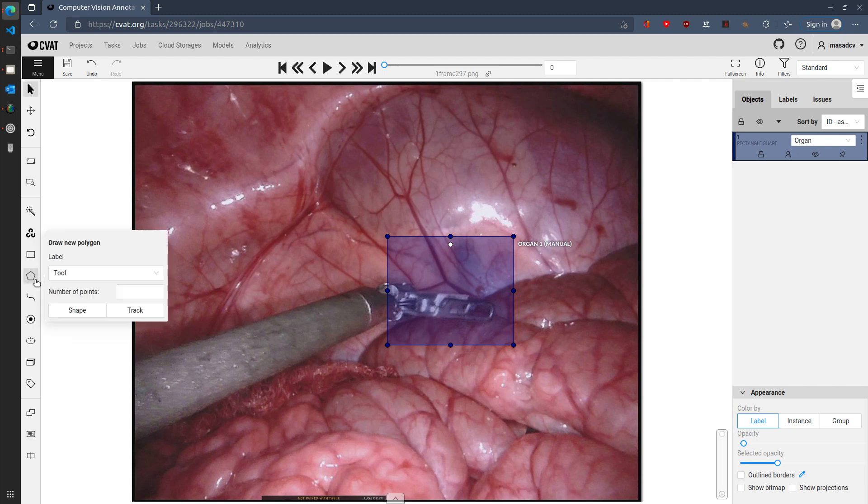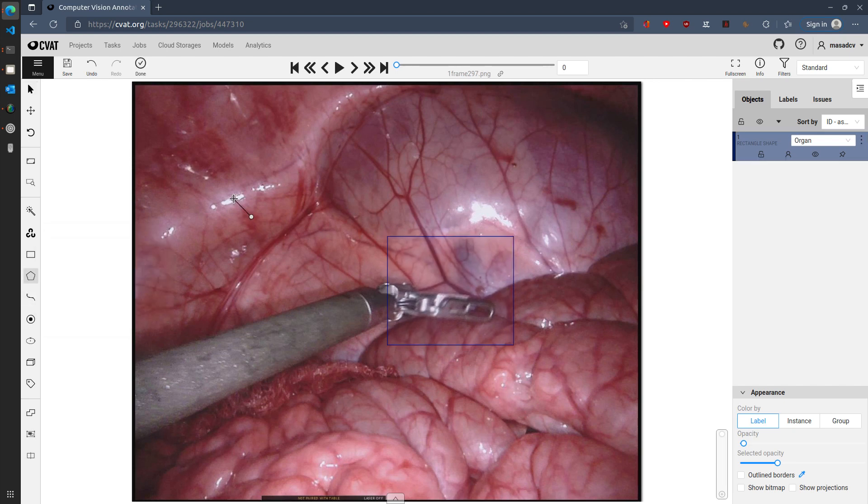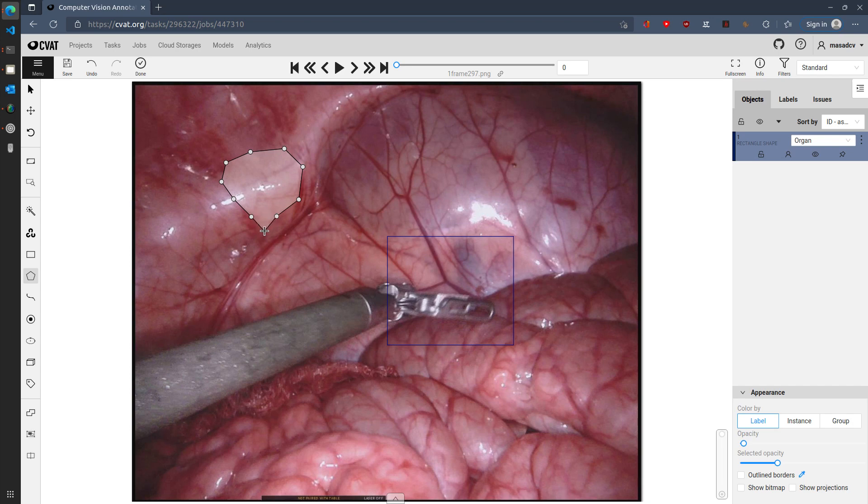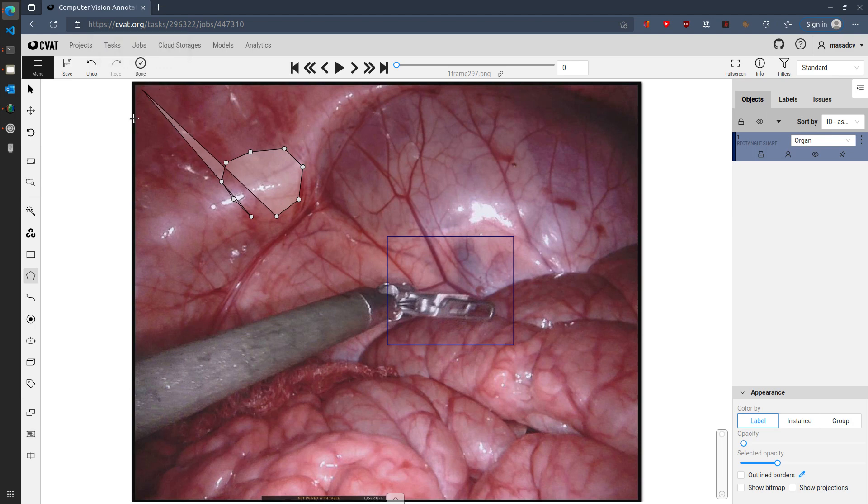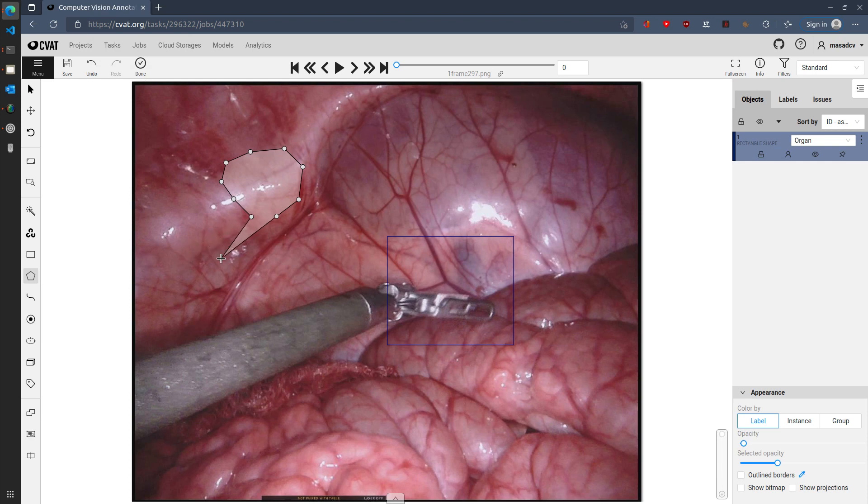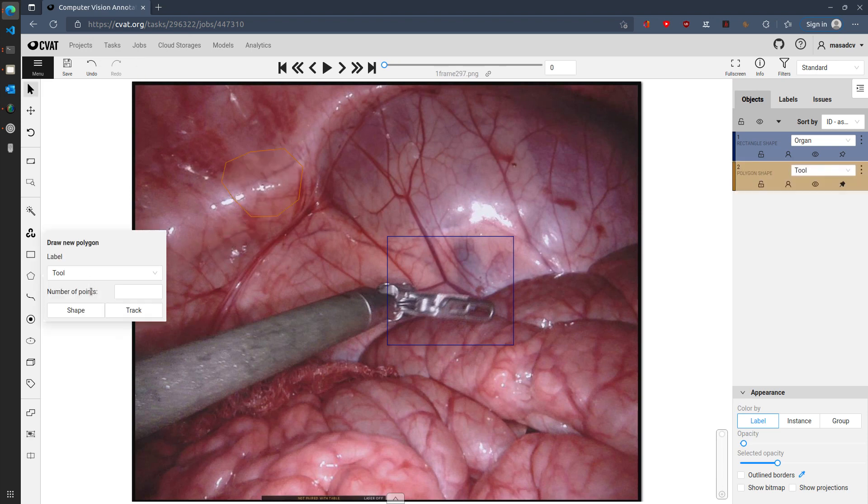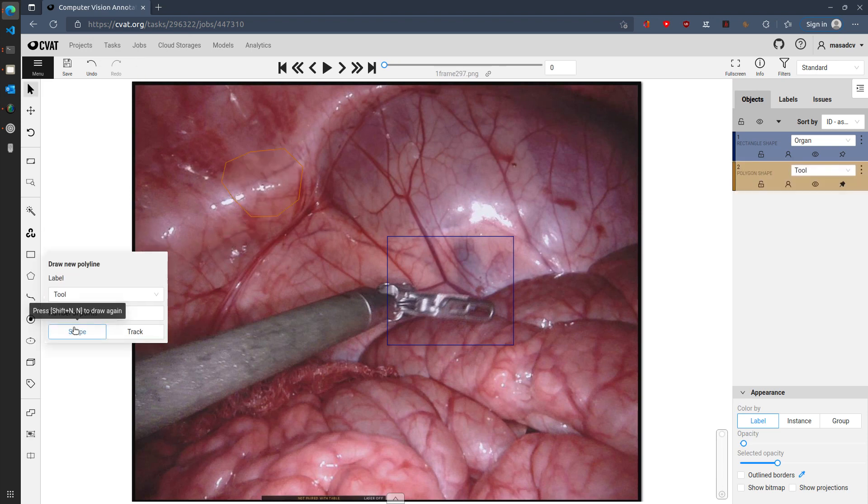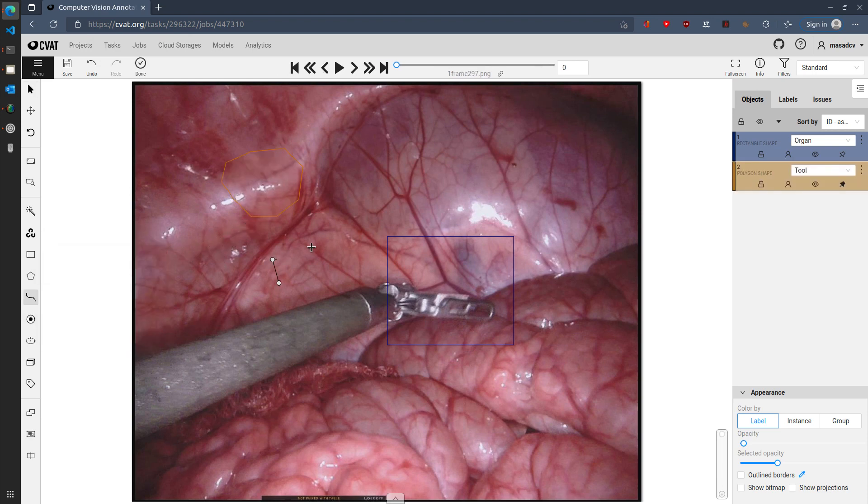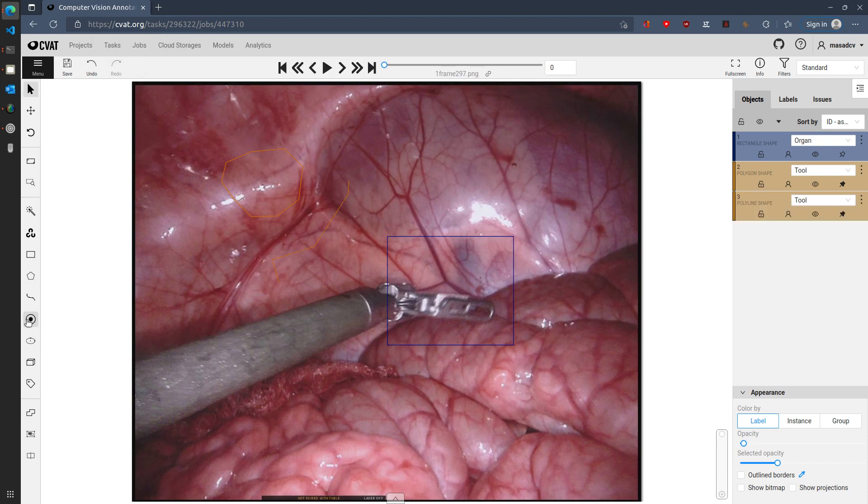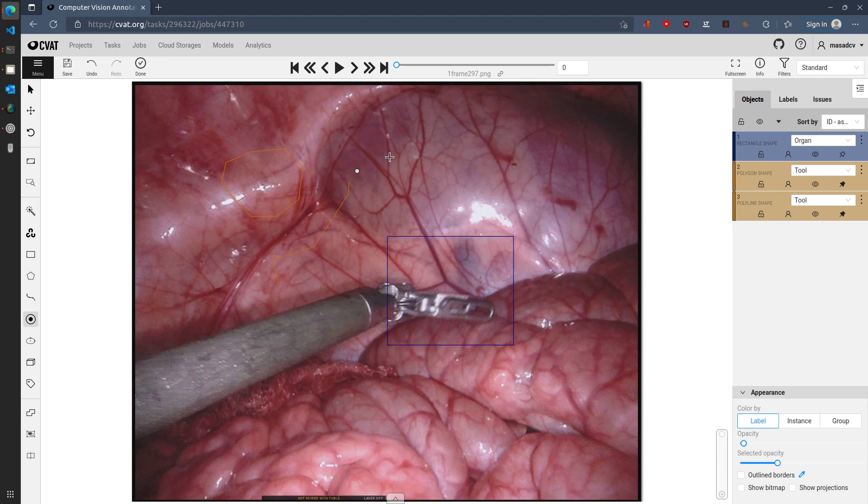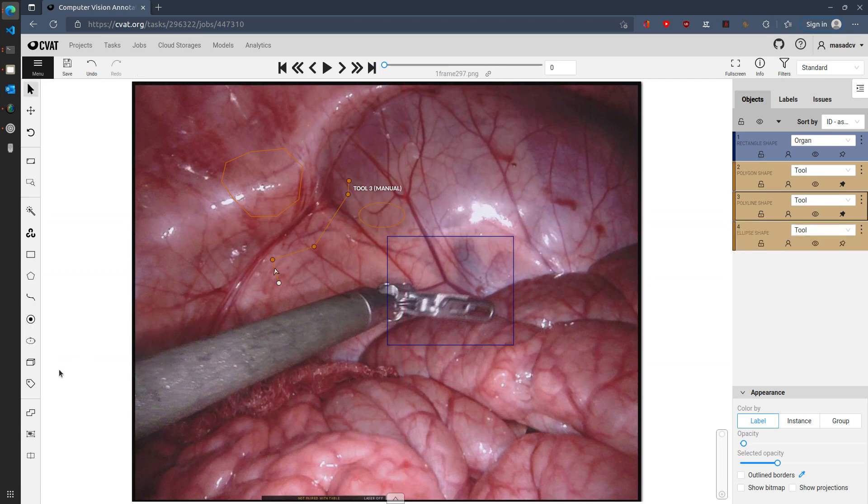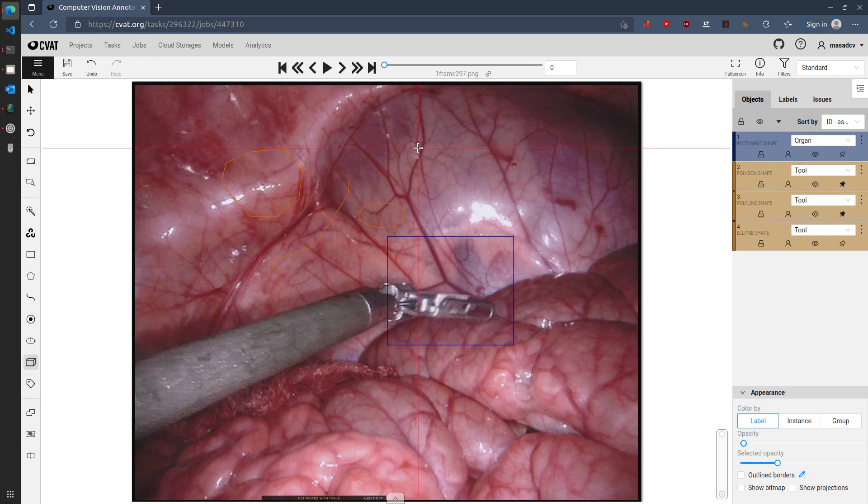Similarly, you can add a polygon annotation. So that can be done with multiple points. Once done with polygon, you can save it by clicking on done or clicking on polygon or using the key N on your keyboard. In a similar way, you can add a polyline as well as points, ellipse, and cuboid.